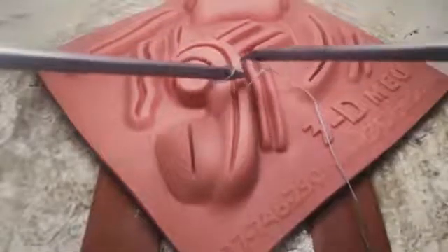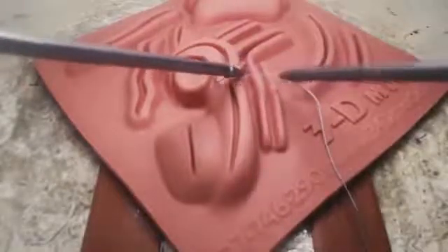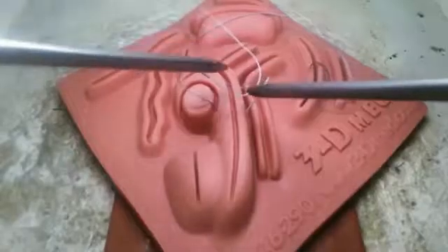Throw the surgeon's knot in the same way as before, supinating and pronating to make your loops. Here's what happens when you tie on the wrong side of the loop.